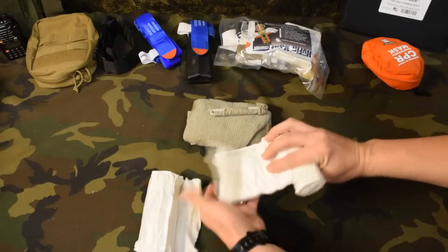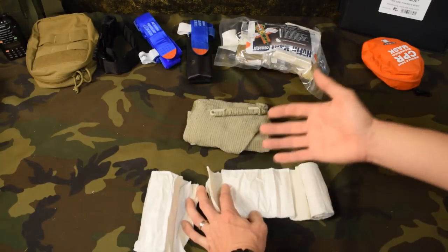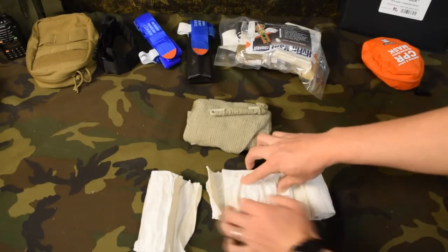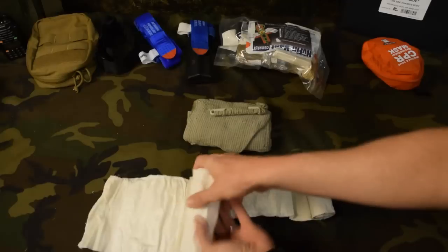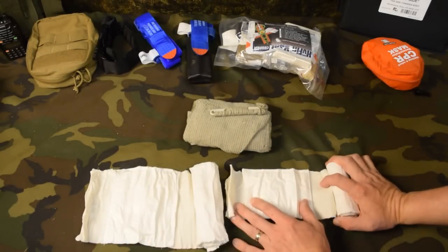As we roll the product out, this is our bandage — this is where we'd actually put the wound. You can use it on an extremity, abdominal area, even a chest area — pretty much head to toe. This is where the wound would go, and you do note that you get a larger surface area with the six inch bandage than the four inch bandage.